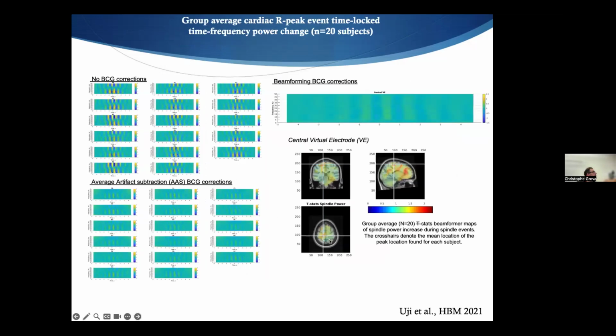And then we applied our beamformer. So we have our beamformer map here. Here we looked at one virtual electrode that we put here. We looked at these locations because we know this is an important region where spindles are generated, and we were interested in spindles. When you look at the average ballistocardiogram in that region and make the statistical test, it significantly decreased even compared to the subtraction method. So that was a nice way.